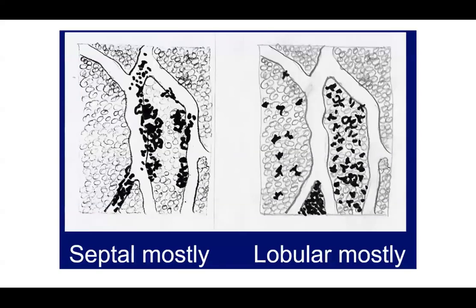On the left, you have mostly a septal paniculitis — inflammation traveling along the septa with some spillage into the lobule. Whereas with lobular paniculitis, you mostly have inflammation within the fat lobules themselves and not really tracking as much along the septa.